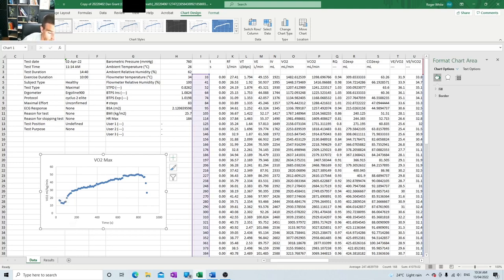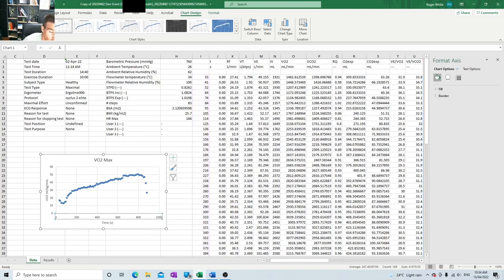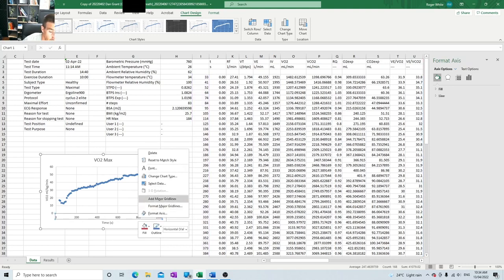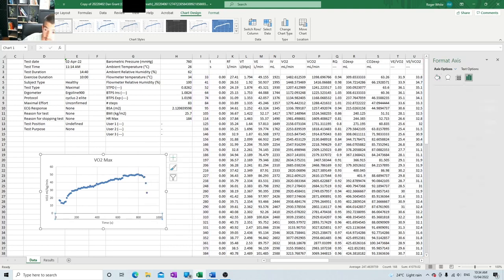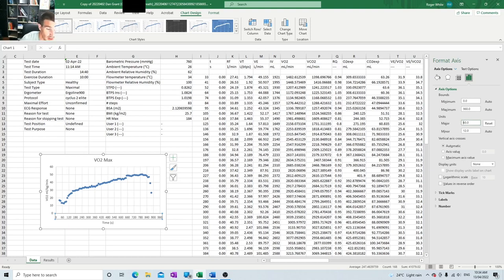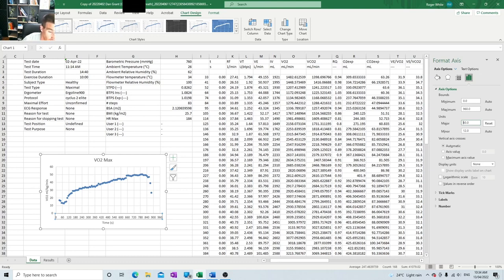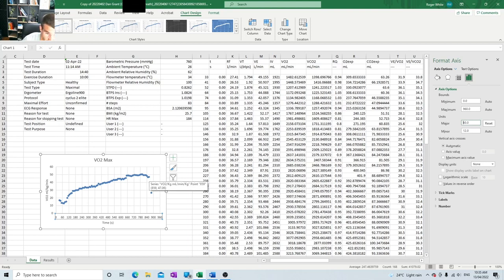Now, with our seconds, the axes format here, at the moment, it's listed as 200, 400, 600, which isn't too helpful in our situation because time stops went up every 30 seconds. So I'm going to change that to format axis. We're going to change that to 60. So that way it reflects minute increments. So every 60 seconds, now we've got a little line of where it happens. And you can see that the first 60 seconds, they were just sitting easy here. After that, they started exercising and you can see that oxygen consumption quickly rises. Then it starts doing its incremental steps. But there's a big difference, big jump from rest to where it starts. Here, you can see that's where the test finished. That's where they reached exhaustion and then collapsed.